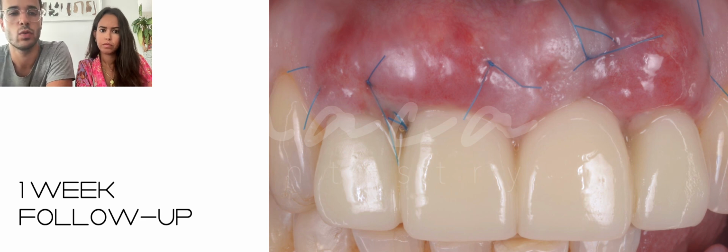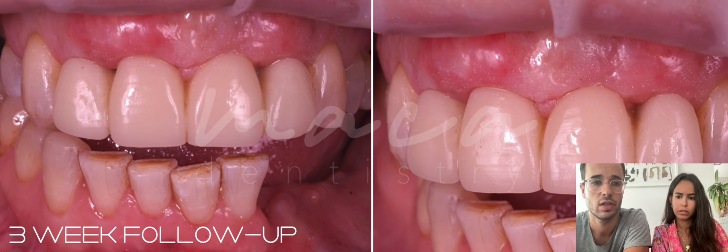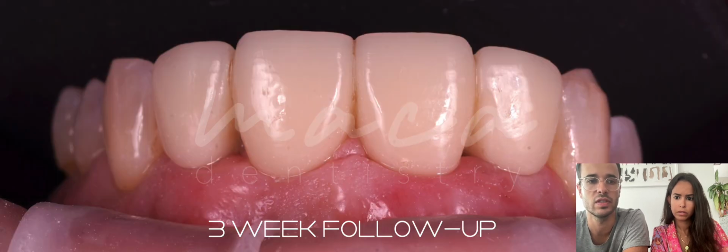Here you have 1 week of follow-up of the surgery. We have a pretty decent healing. I think the tissues are looking very good. And this is 3 weeks after surgery. It's pretty decent. Good improvement of the aesthetics.